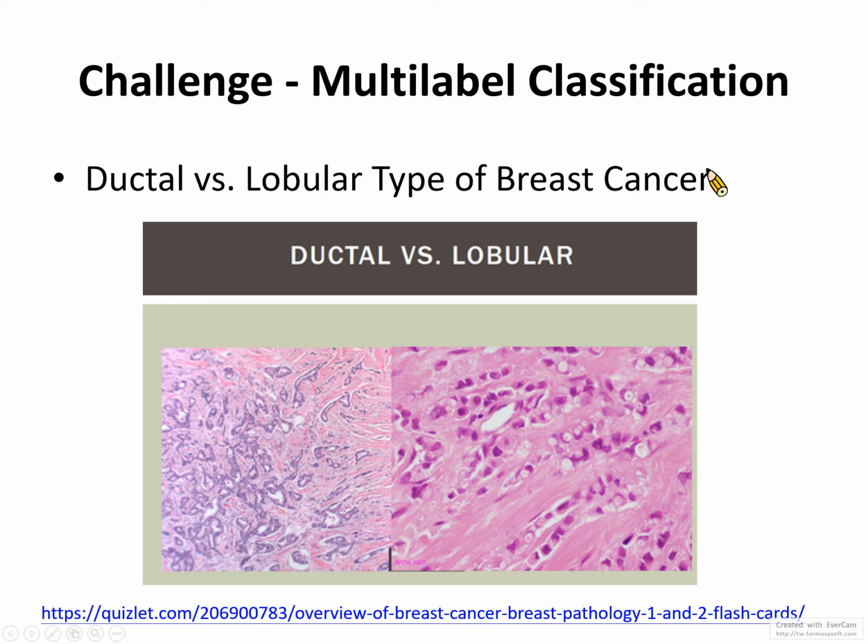But I just want to emphasize that we always need multi-label classification, just like when we want to find out if the image contains trees, dogs, cats, other animals, or any persons. So we always have multi-label challenges in imaging deep learning.